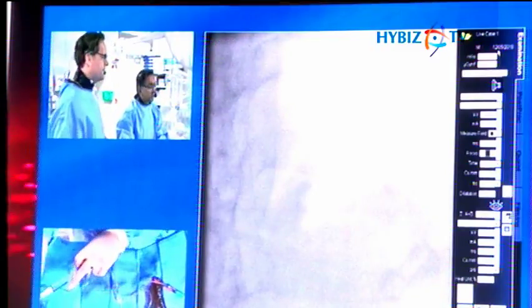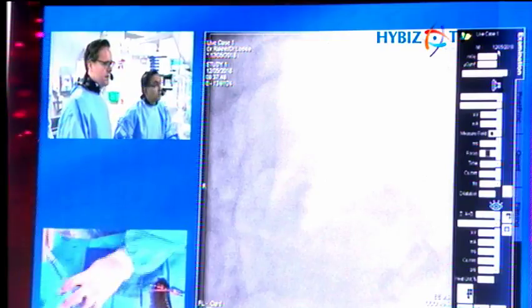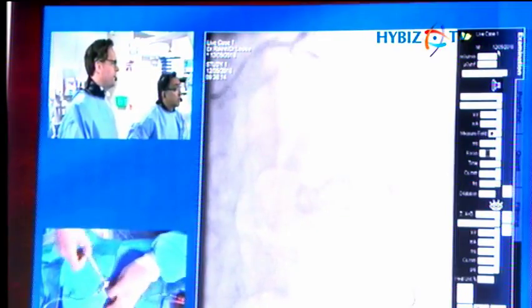Also, with a distal reference of only 3.5, if you wanted to get up to 6, you'd be looking at one of the bigger platforms like the Promus 4mm or the Onyx 5, but that would be too big distally. And to avoid using overlapping stents as well, we feel we can get away with a single device here.